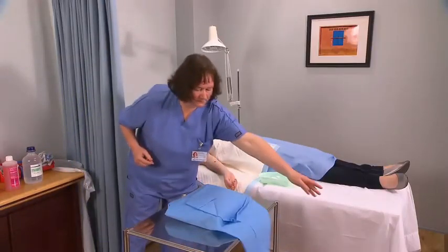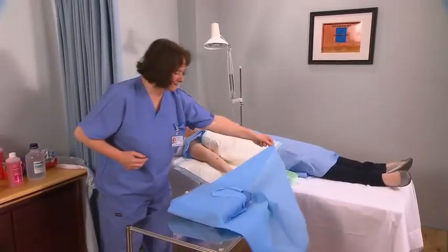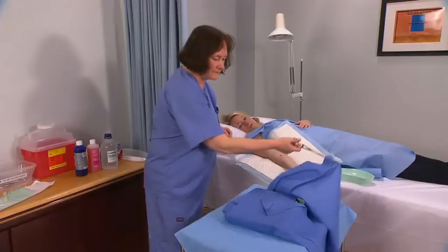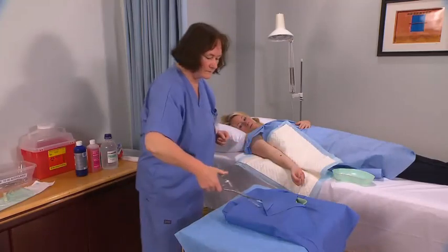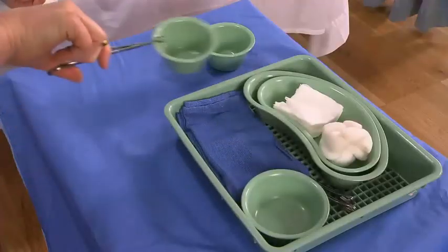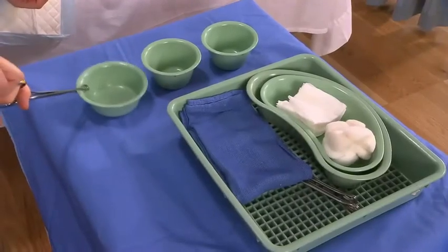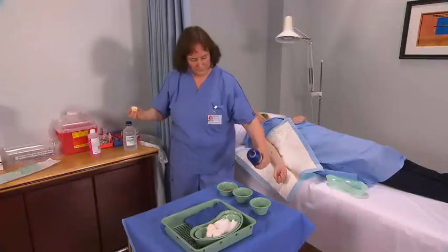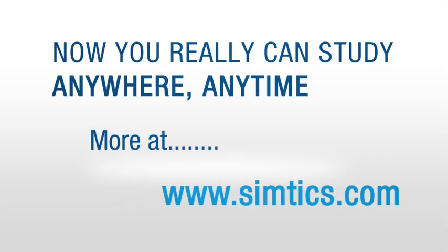Open the outer layer of the skin preparation pack. Using sterile transfer forceps, open the inner layer of the pack and arrange the small bowls and equipment within the pack appropriately. Fill one bowl with surgical soap, one with antiseptic solution, and the other with sterile saline.